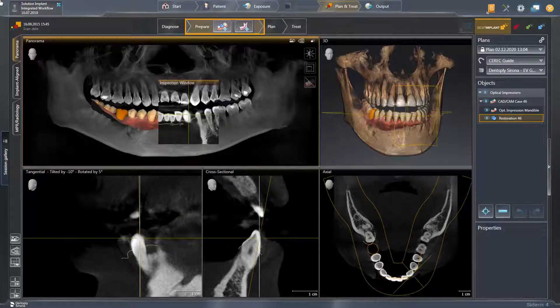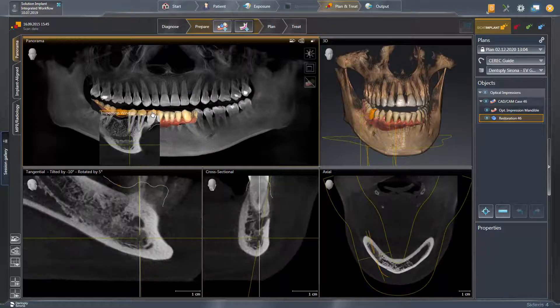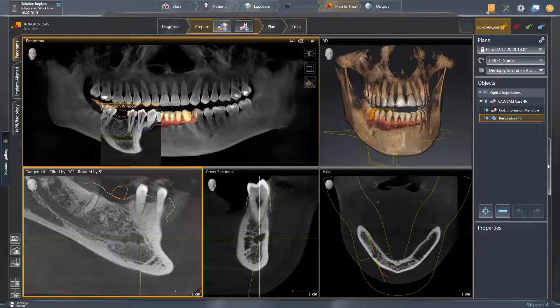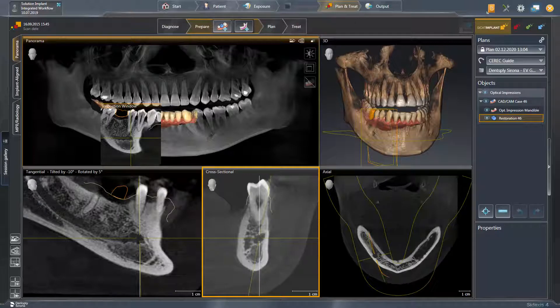We are in the prepare step and move the inspection window in the panorama view to the mental foramen. Then, we adjust the tangential view in such a way that the complete path of the nerve can be seen. The mental foramen should be visible in the cross-sectional view.